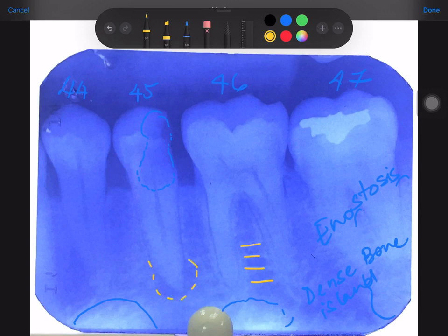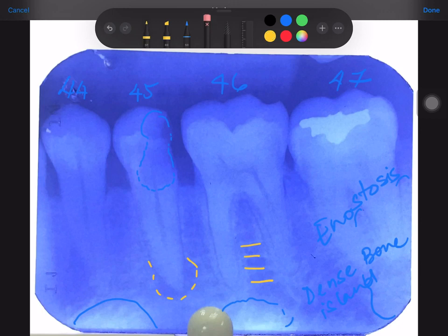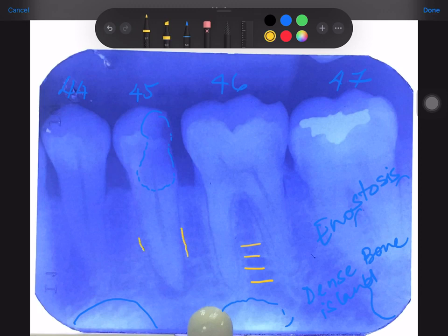Going back to the premolar: there's a well-defined radiolucency here. What has happened to the PDL and the lamina dura? There is loss of lamina dura — you can't make it out anymore beyond a certain point. The PDL is widened and the lamina dura is completely lost.